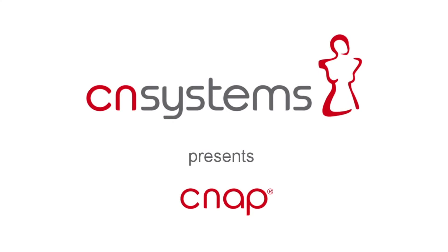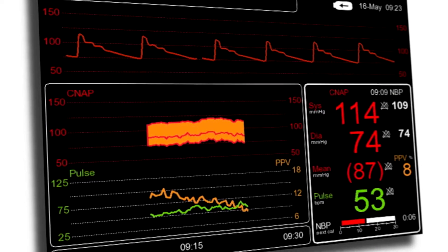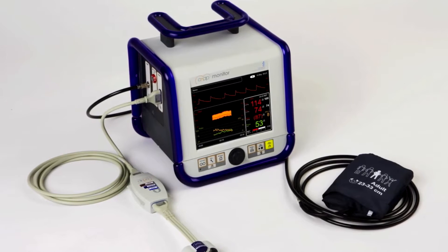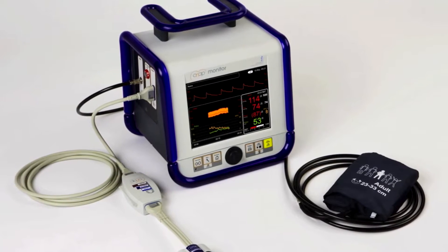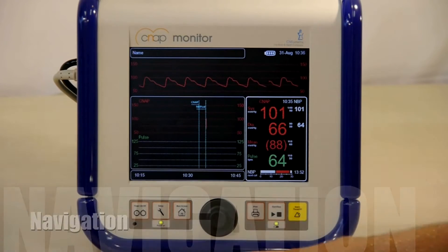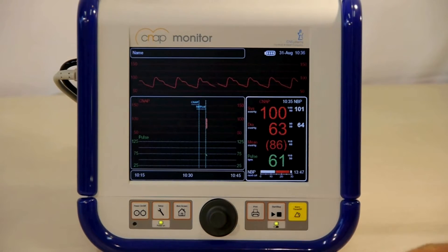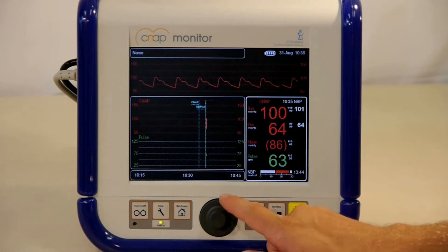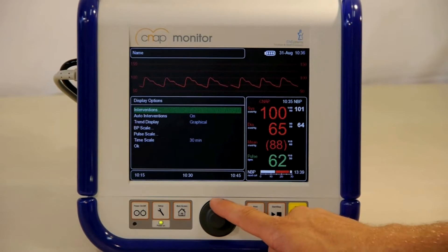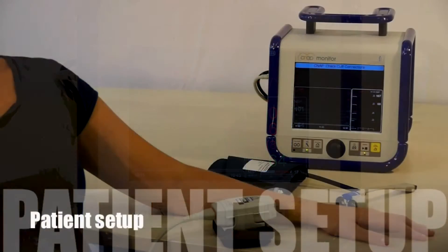CNAP is setting new standards in hemodynamic monitoring for use in research, the operating room, emergency department, intermediate care, and all situations that require continuous blood pressure monitoring without cannulating the patient. CNAP utilizes a simple non-invasive setup to provide a high-fidelity blood pressure tracing. With validation on thousands of patients, we have proven that CNAP can match an invasive arterial line in terms of accuracy and the morphology of blood pressure tracings.